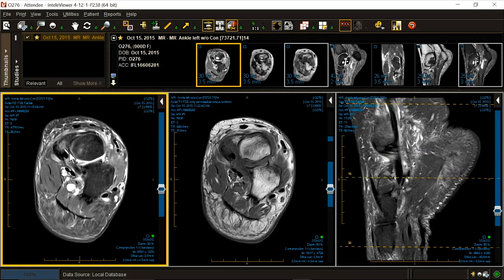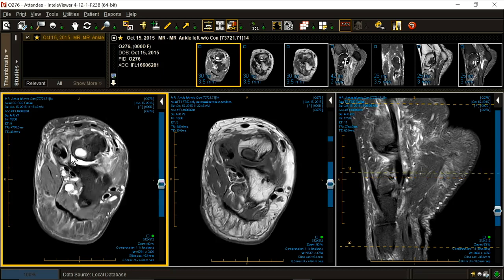Down low, this tendon is a registrar's dream because it inserts on everything. All you have to remember is the navicular and every other bone. So if they give you some other multiple choices, say yes. But now let's work our way backwards.